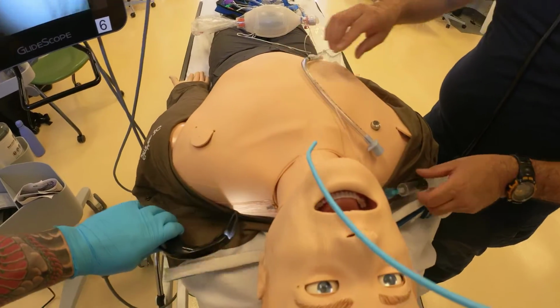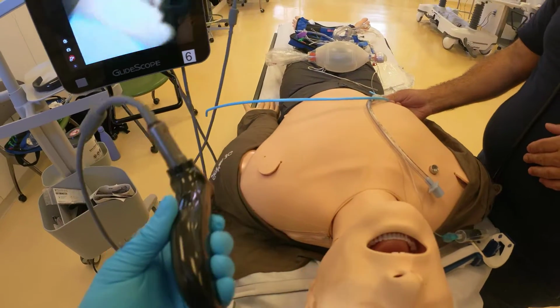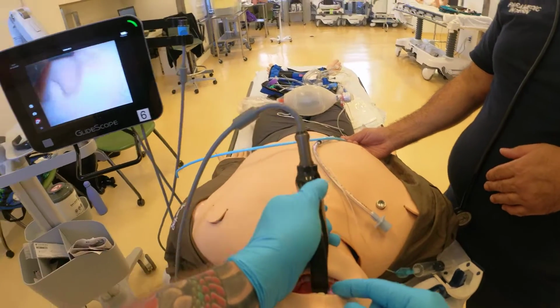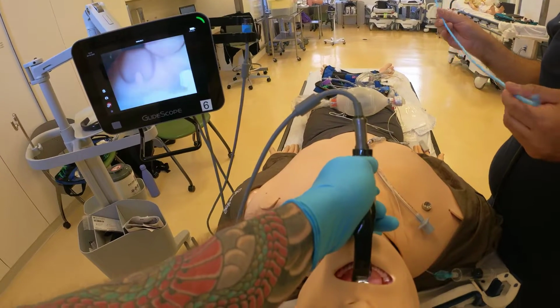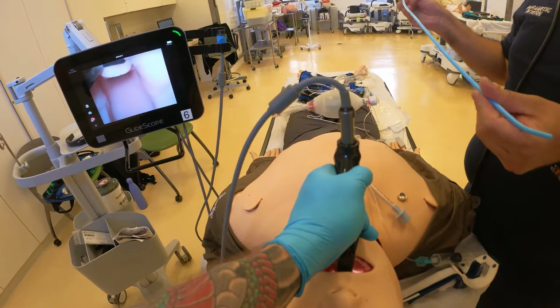And I just want to show you, right? So people say, well, how do you know you're in the right spot, right? So hold up is usually the best location. So let me put the screen up, right? Again, uvula, go into, find my epiglottis, right? And I get a 50% view.